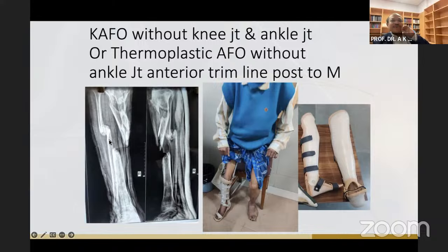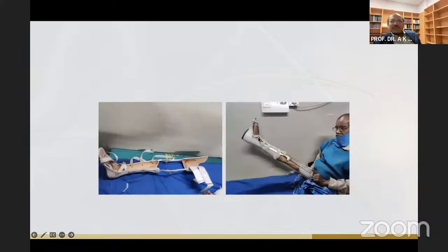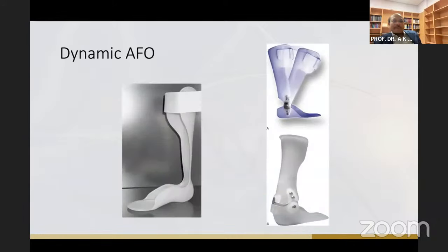So that is how nature has given some avenues open, and that allows some weight bearing. So ischial weight bearing is not required. Still, a little bit of indentation was done. So if the patient wants to keep some body weight temporarily, they can do that. But it doesn't require significant weight sitting arrangement during walking.